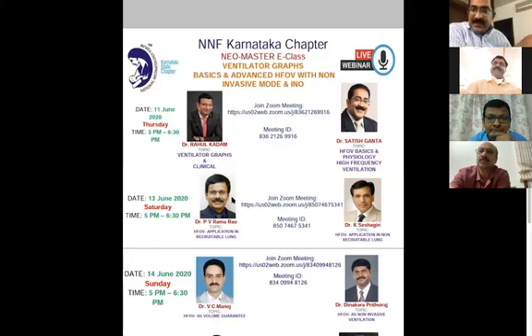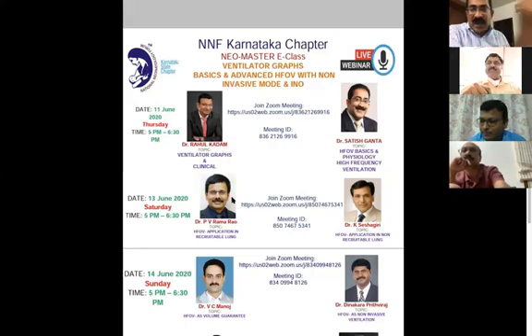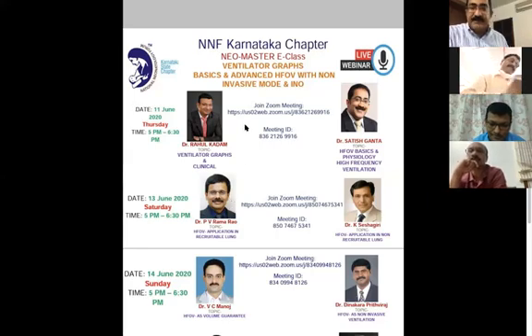So one, you should know what you start with. That means the nurses are getting the baby ready, you're about to set the ventilator, so you have to have a number. So what I do is practically based on what my CO2 level is earlier, I choose my delta P. Clear? Number one.